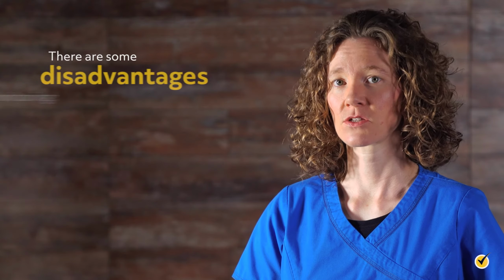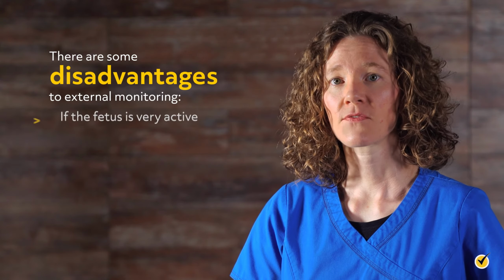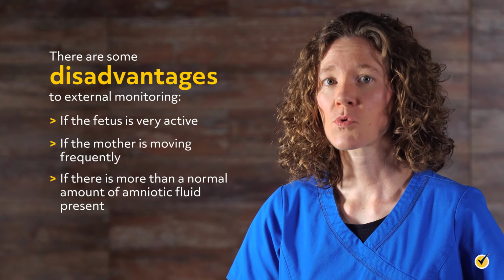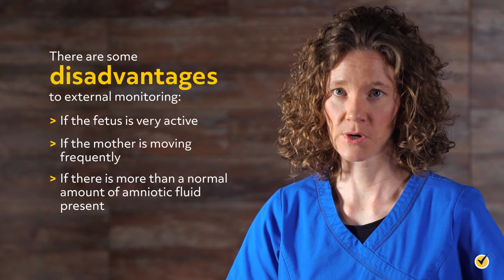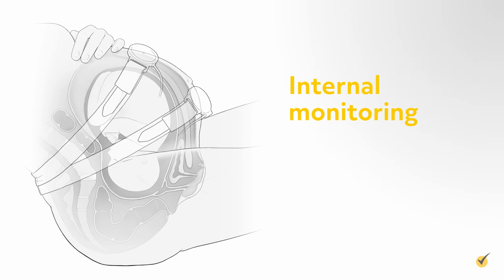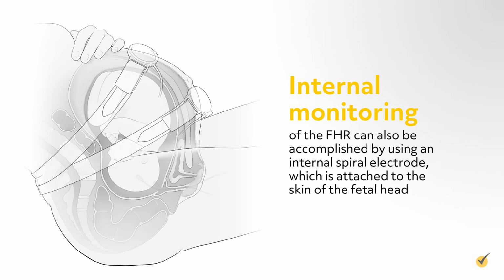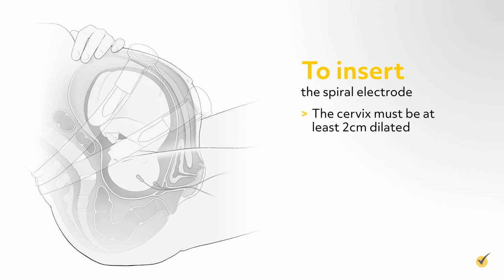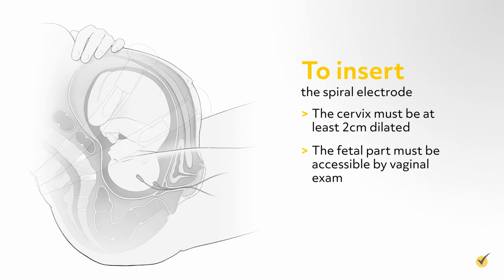There are some disadvantages to external monitoring. If the fetus is very active, if the mother is moving frequently, if there is more than a normal amount of amniotic fluid present, or if the woman is obese. Internal monitoring of the fetal heart rate can also be accomplished by using an internal spiral electrode, which is attached to the skin of the fetal head. To insert the spiral electrode, the cervix must be at least 2 centimeters dilated, the fetal part must be accessible by vaginal exam, and the membranes must be ruptured.